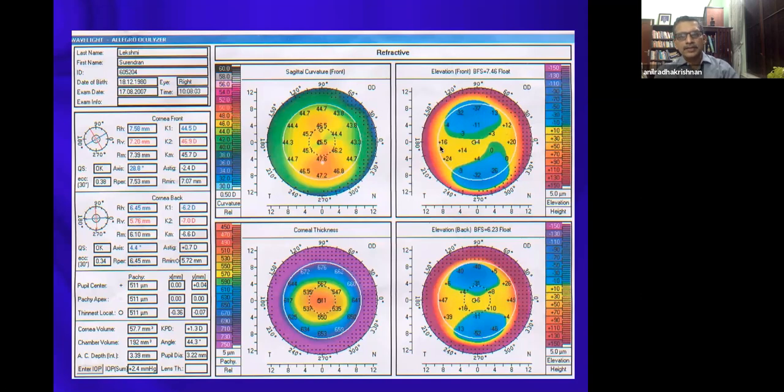But this is in the peripheral part. This is a patient who has astigmatism, so you expect these areas to be high. So don't look into that. Actually, in this patient you have to use a toric surface, and only then can you basically evaluate it.